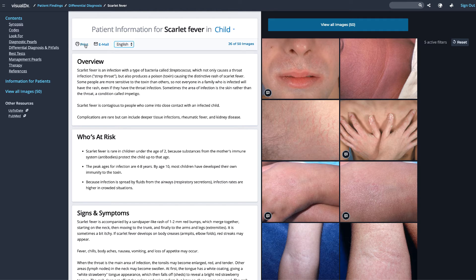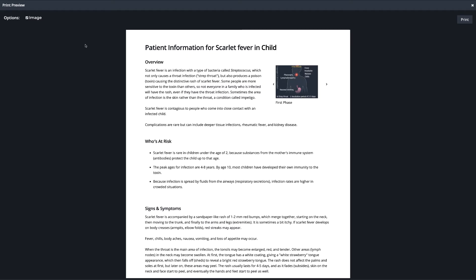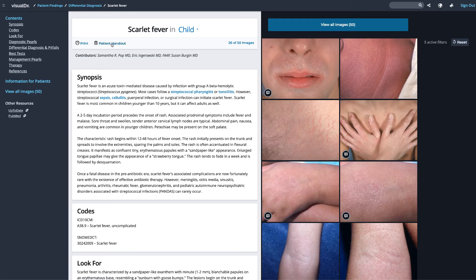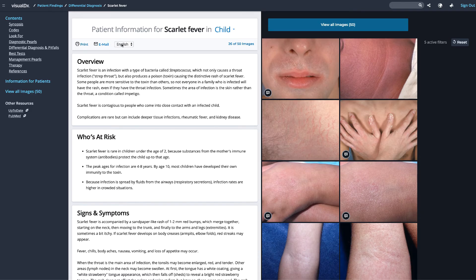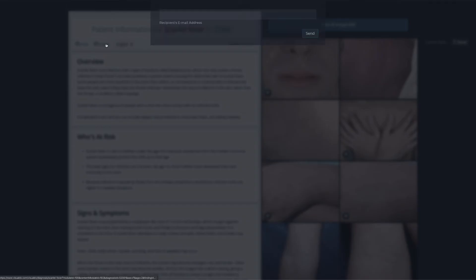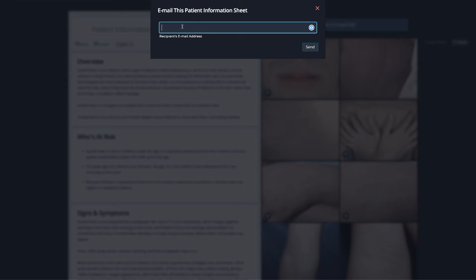Edit the image in the top right corner to choose an appropriate photo, then click email and fill out the patient's address. More than 300 handouts are available in both English and Spanish.